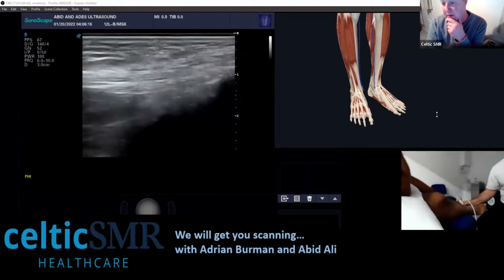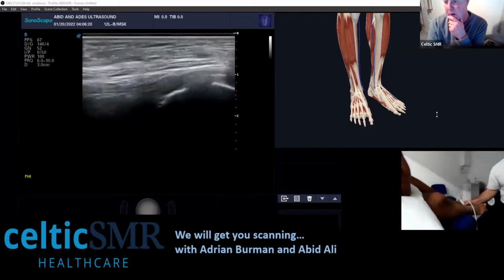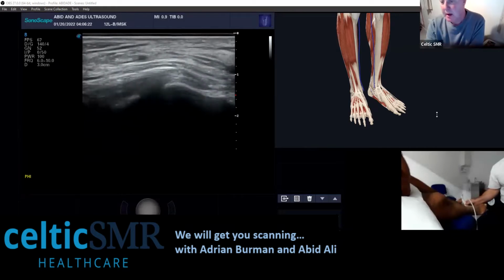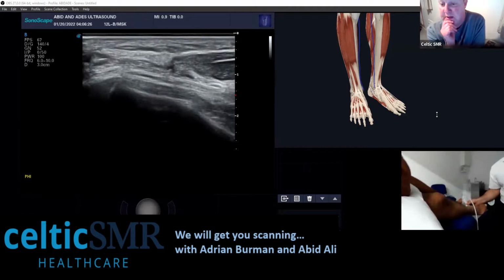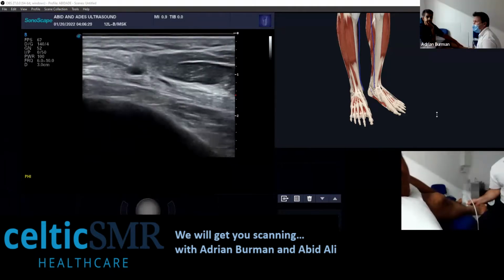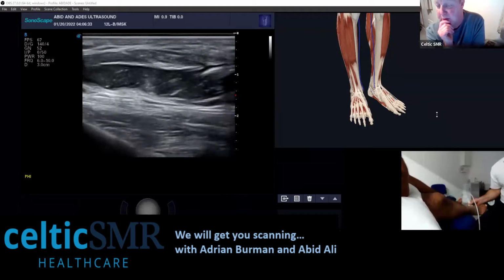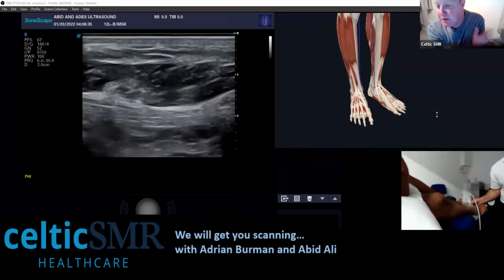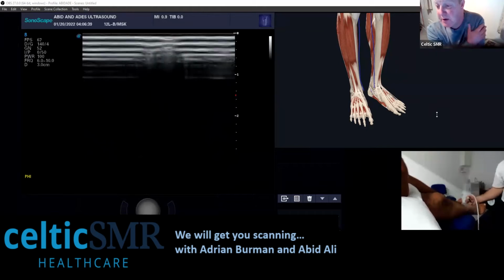I did have a question here from Sandra. Sandra, sorry, had you completed that then? Yeah, no, I'm just carrying on following the nerve. Sorry, I'll check in with Zoe that she's happy with that. We can always come back to it. But a question from Sandra, I should say. Sandra says, I have come across cobblestone a few times. Is this always due to cellulitis?